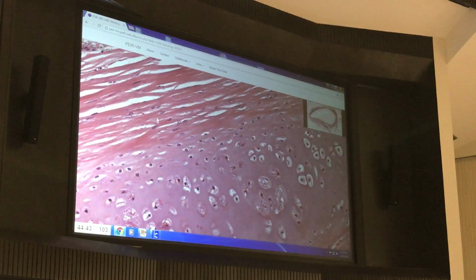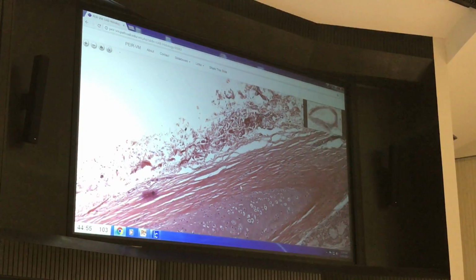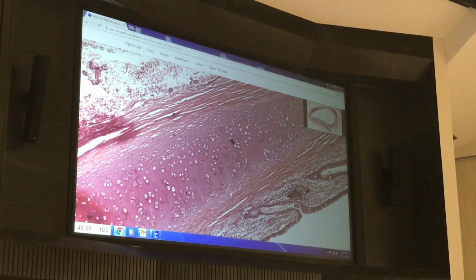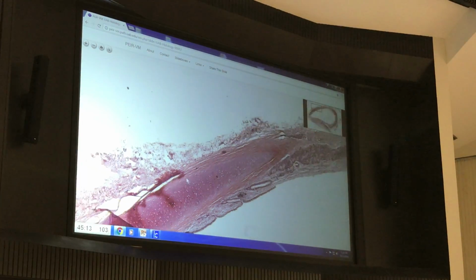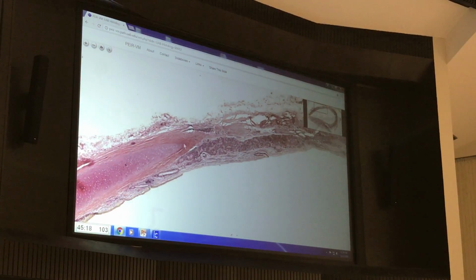And you see how regularly stacked those collagen bundles are. Little fibroblasts squeeze in between them. So around cartilage, kind of helping support it, you can see it's going to be wrapped. If you go a little lower, you can really see this is a nice example of dense regular. So all our pieces of cartilage, because cartilage is one of that exception that it's not vascular, because it acts as a little sponge compressor, it's going to be totally surrounded with what we call, don't worry about the name, perichondrium.